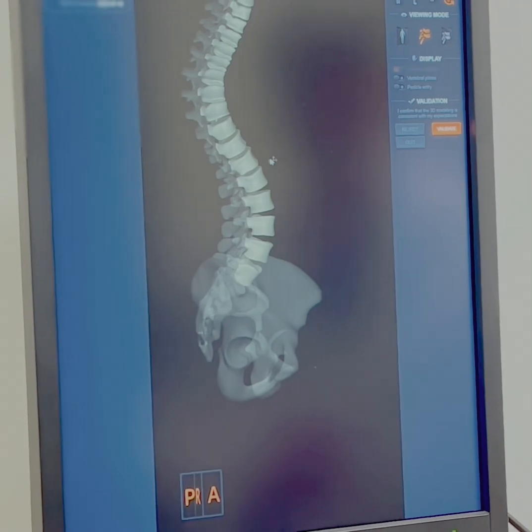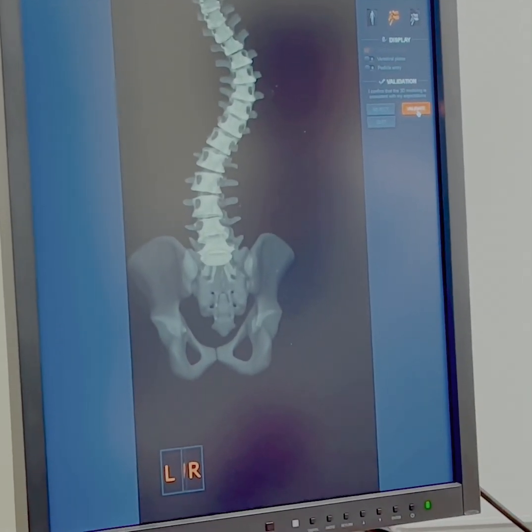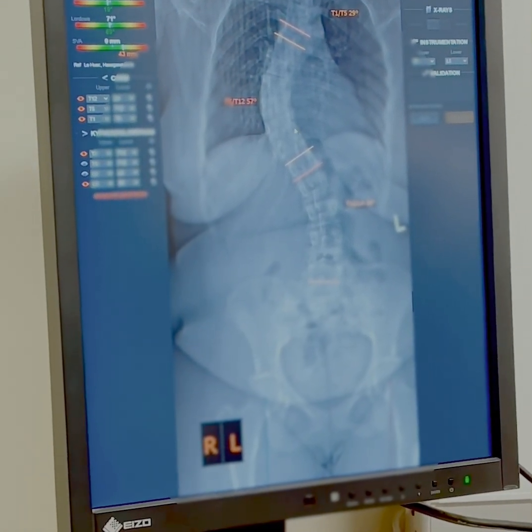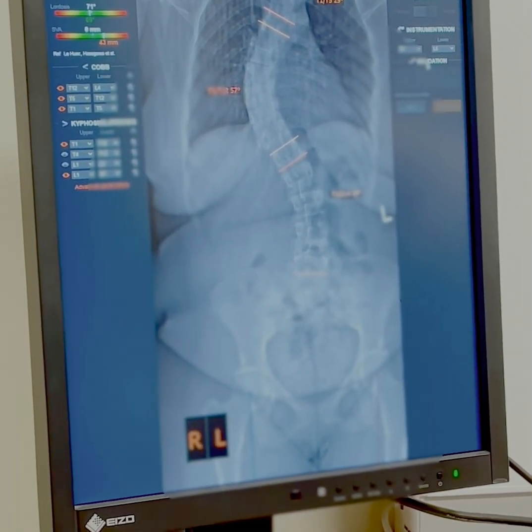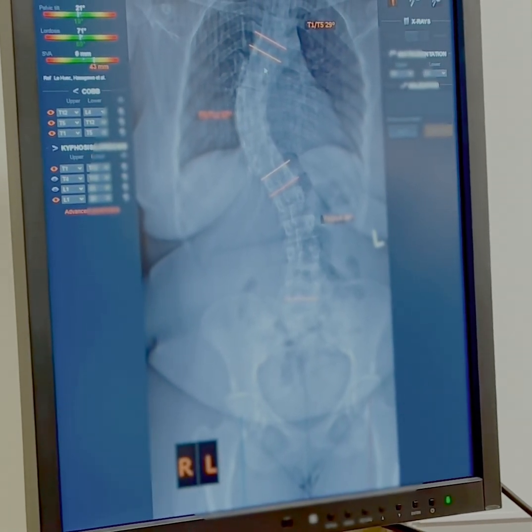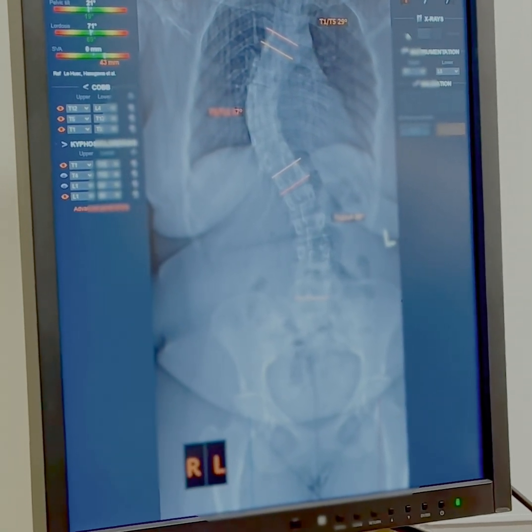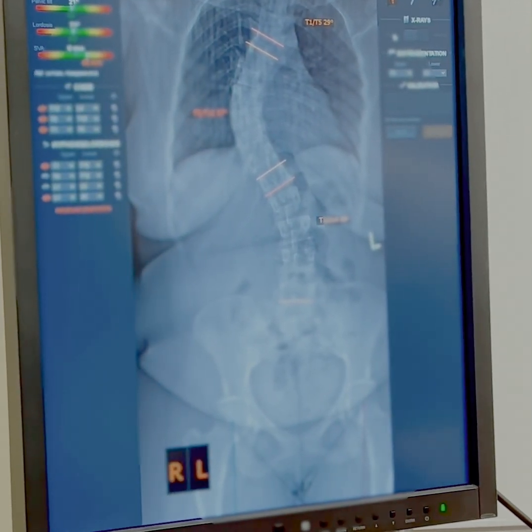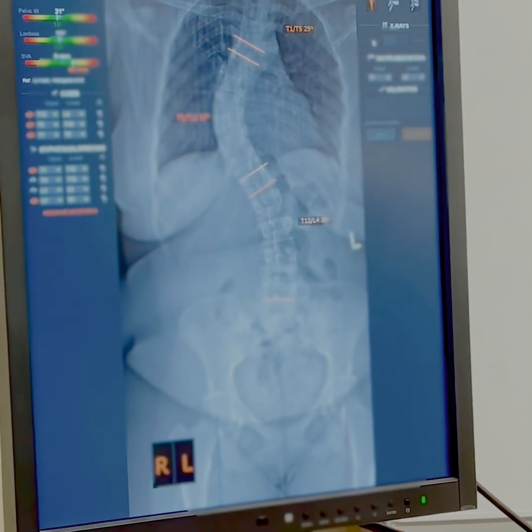And even after this, what we can now do is go ahead and start drawing lines, and what this will do is we can actually decide where the curves are and then start putting instrumentation on the spine itself. So it's a preoperative planning which allows us actually to perform the surgery on this model, and then we also do create models, which will be a different segment that we'll talk about on how we can be more precise when we have to do surgery.